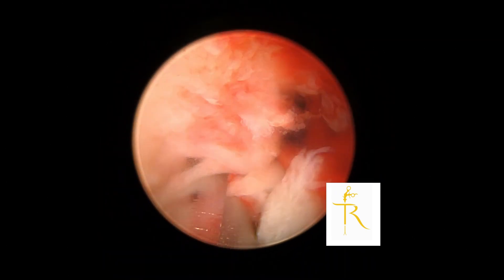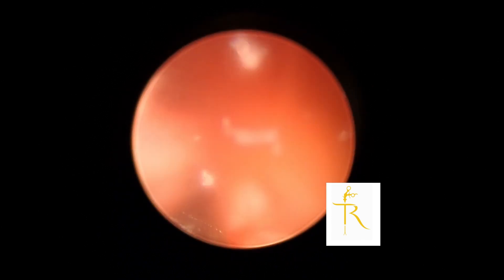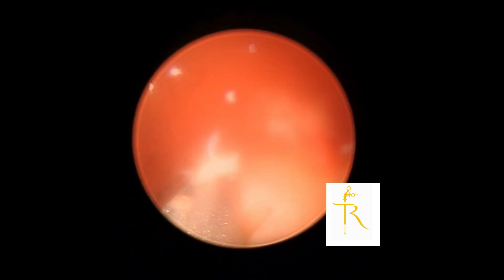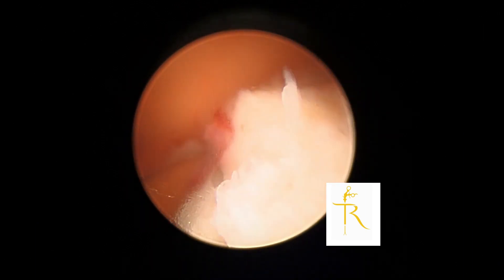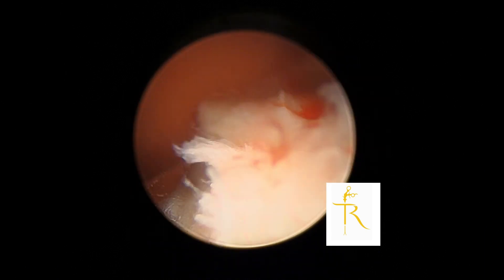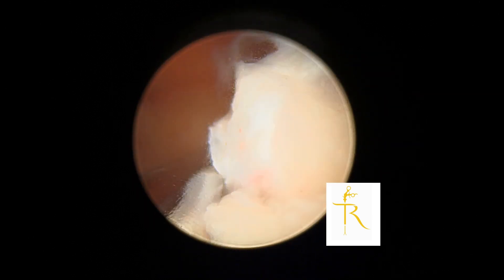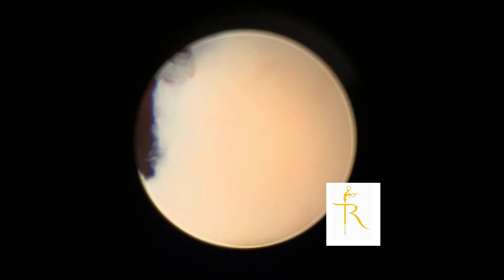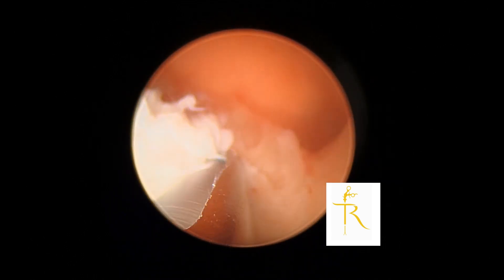I've gone ahead and used a mechanical morcellator, and I do find it to be quite useful for resection of fibroids because it actually takes away the tissue as well, so there's no tissue blocking the visual field. I often compare this to a game of Pac-Man when I teach my registrars.